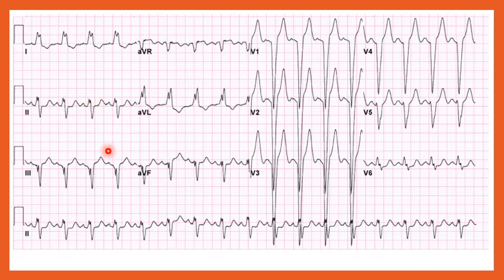Okay, so first of all, when you have a 12 lead EKG that prints out this beautiful rhythm strip on the bottom, it's always a good place to start because the rhythm strip on the bottom is typically in lead 2. Sometimes the V lead will also be added down here, but it's really nice because it gives you a real long strip of the patient's rhythm, which we know here to be sinus. Okay, so this patient is in sinus rhythm. Now, let's go up and look at the width of the QRS. My eyes first go to V1 and V6.